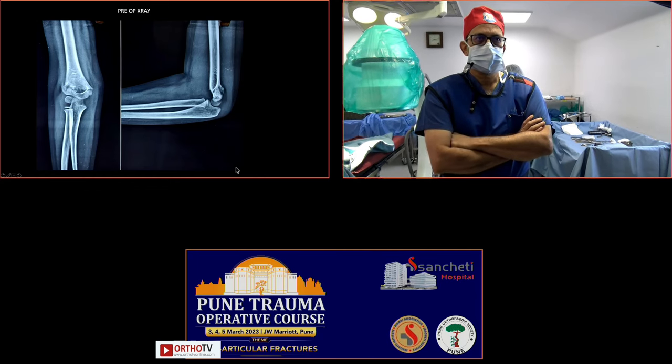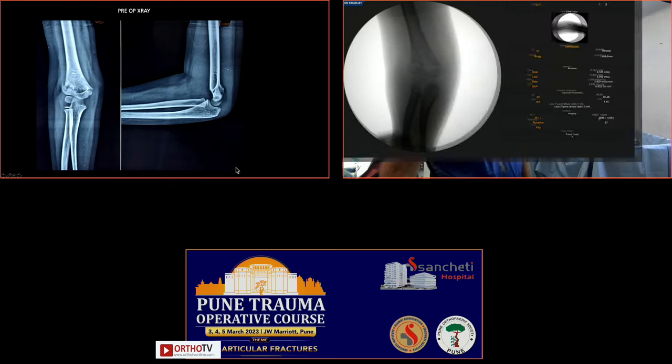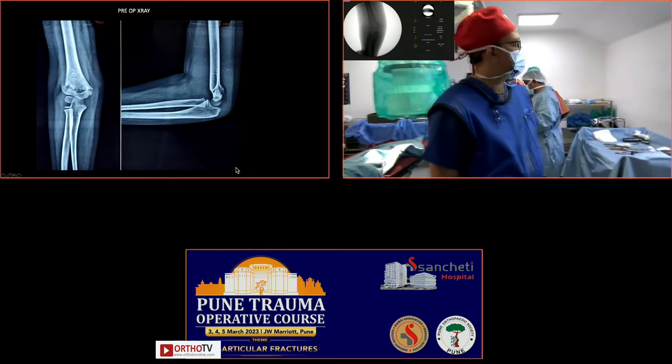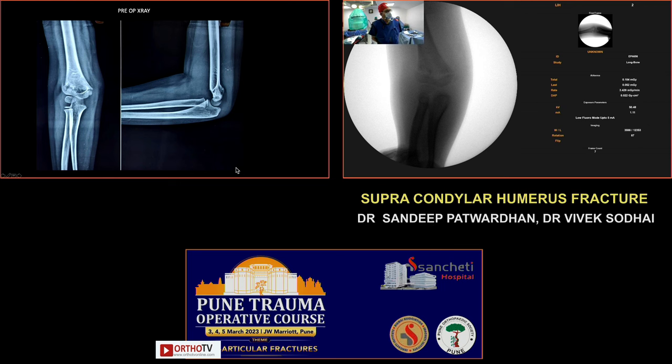So Sandeep, is this a type 2 supracondylar fracture? We'll also put it to the panelists. Dr. Agashi, what do you feel? This is type 2 or medial and lateral? Both columns are broken and there is translation. I think this is type 3 already. Though on lateral it doesn't show, technically this should be type 3. So I will put it as type 3 only. Yes, because it is shifted. There seems to be a shift, not just angulation.